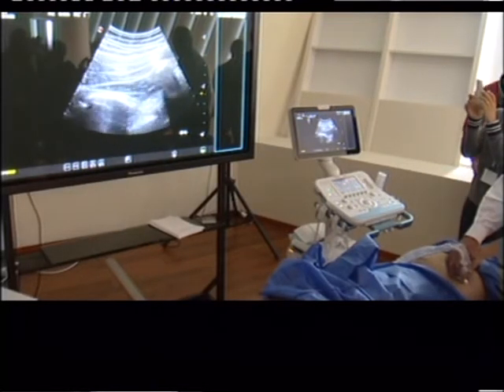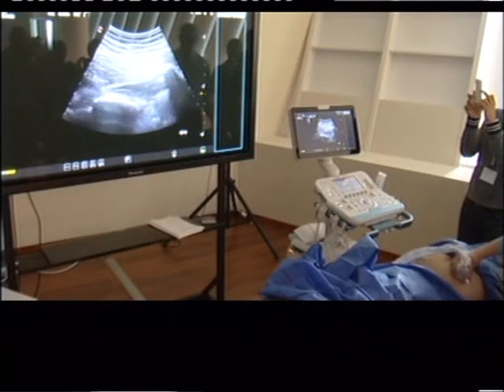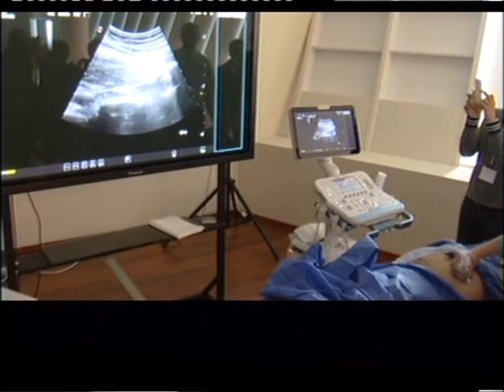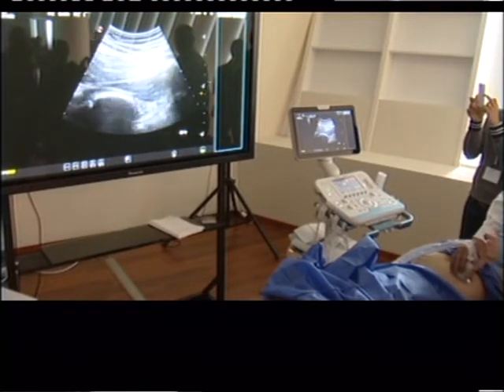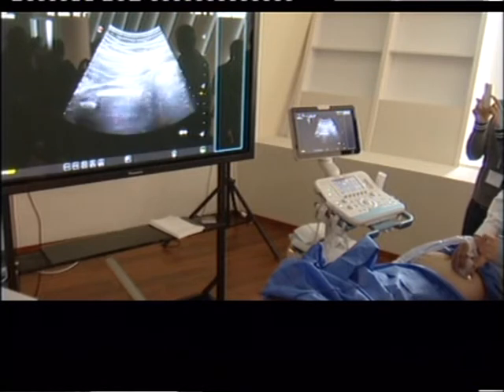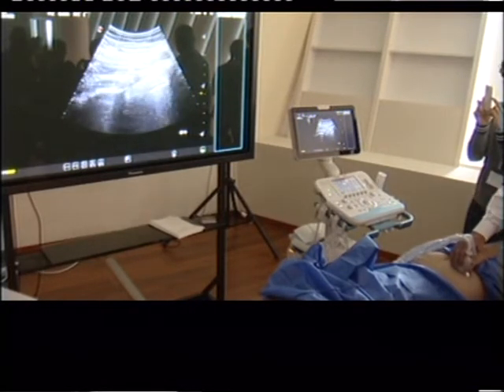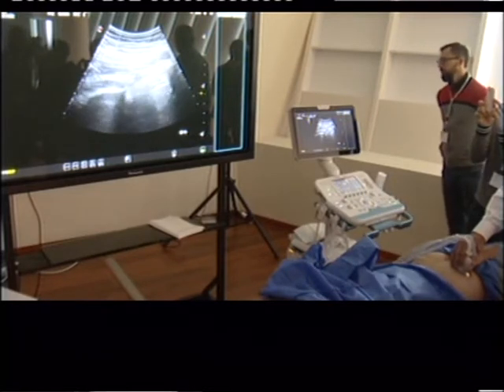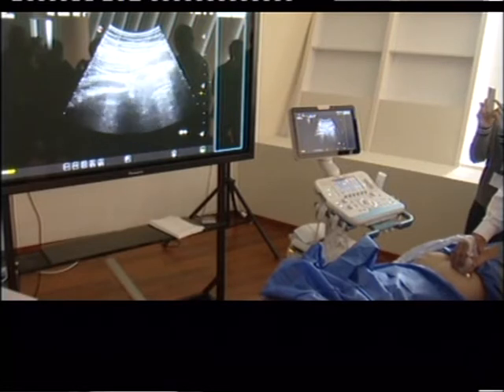Angle a little bit like that. Sacral plexus, pudendal nerve. Now you see it get flat. Sacrum, sacral spinous ligament, pudendal nerve and arteries, sacral tuberous ligament. Right there, pudendal nerve.